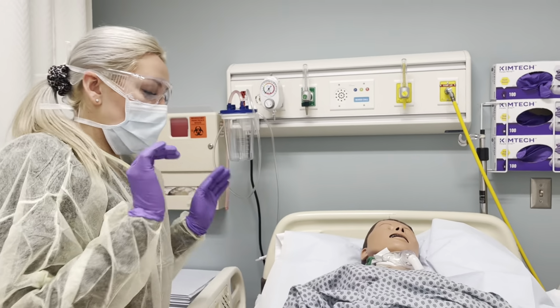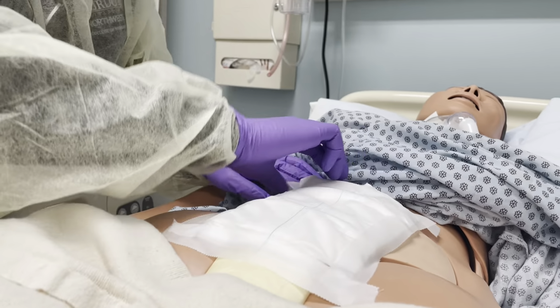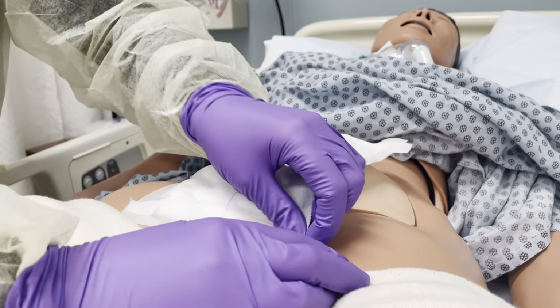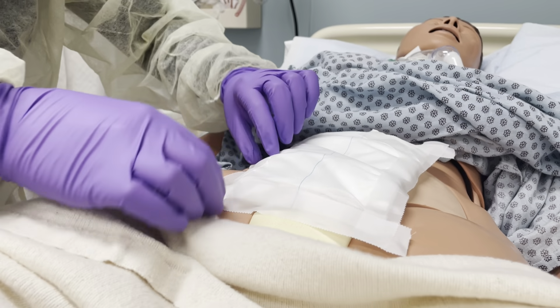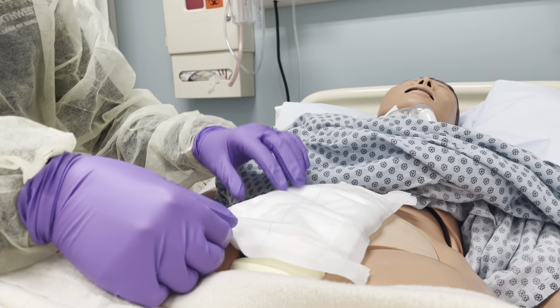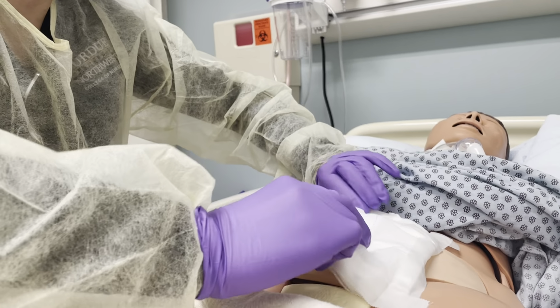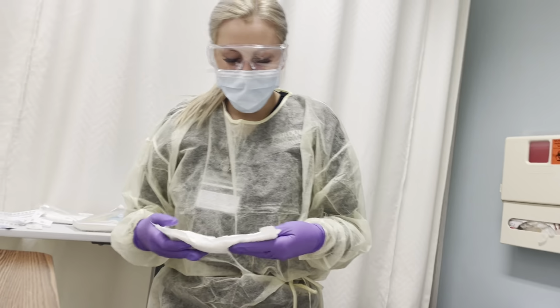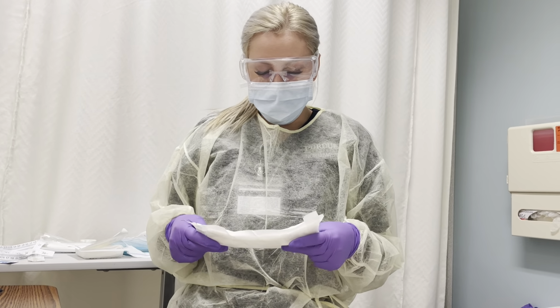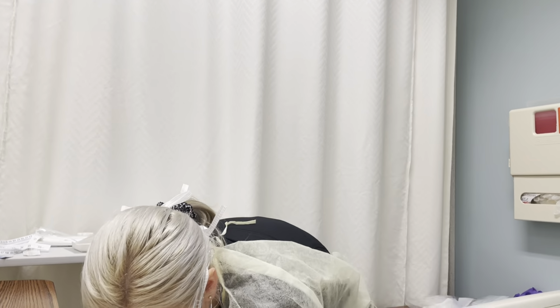Okay, and then by using the push-pull method, I'm going to remove this dressing, making sure to remove the corners first. Okay, and then removing the sides and removing the dressing. I'm now going to inspect the dressing for drainage, so any type of drainage, amount, color, or odor, and there is no drainage present. It is clean. Going to throw that away.